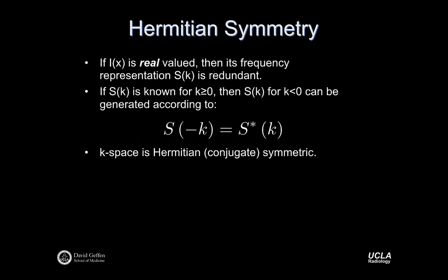We've been talking about artifacts so far, and what we're going to talk about now is getting into some faster imaging topics. Just a couple tricks that we can use to image faster. There's a lot of possible tricks when it comes to fast imaging, and I've said it twice already, but Pung's lecture will address this even more so than this lecture. So an interesting concept that comes up in MR is what's called Hermitian symmetry.